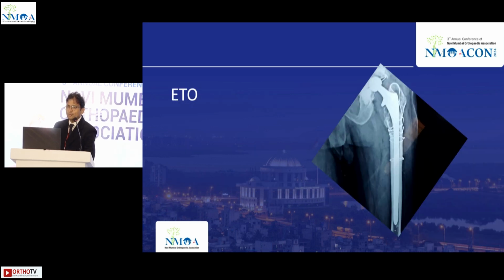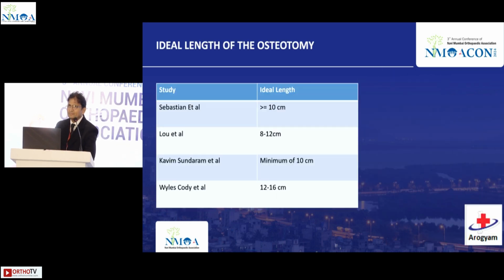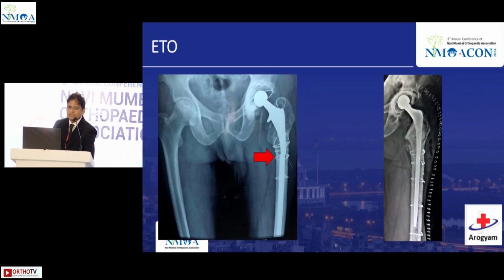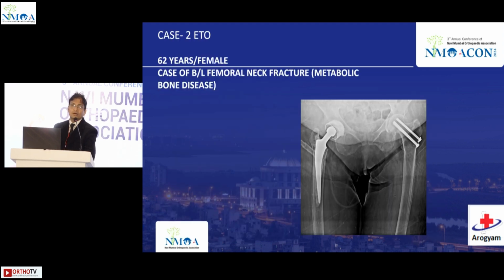So this is a post-op X-ray, and the ideal length varies from case to case. Sometimes maybe 7 to 10 centimeters, sometimes we have to extend to 12 to 14 centimeters as well, depending on the type of stem used in the previous case. There are many references for ETOs. Sometimes you may get a long osteotomy, and the stem may get broken here also, so we had to revise this to a cemented one. There are now many papers coming up for revision with cemented stem in an ETO also.